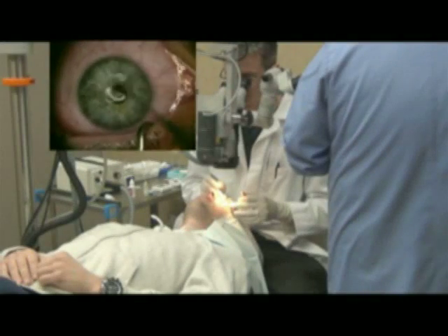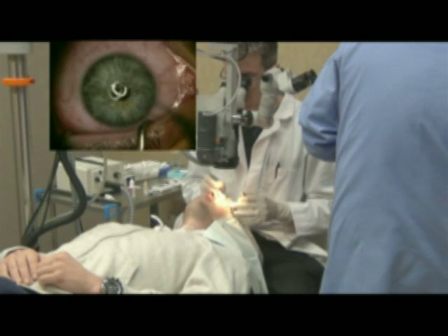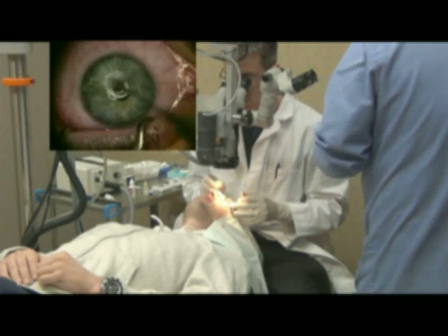Once we've done that, we'll actually remove the skin covering on the surface of the cornea, and this gives us better penetration of the riboflavin, which we're going to drip on the eye next.